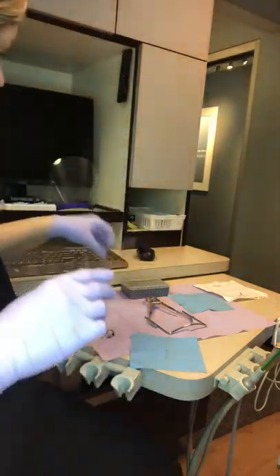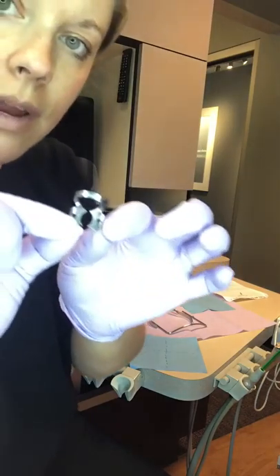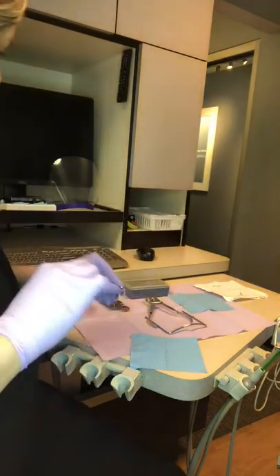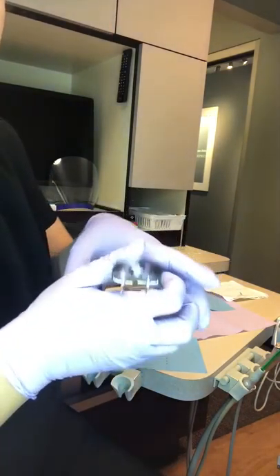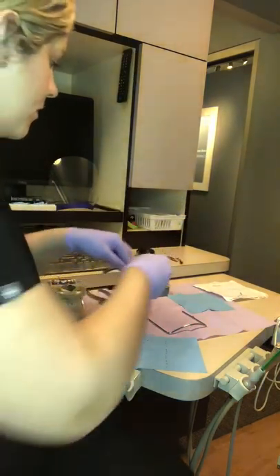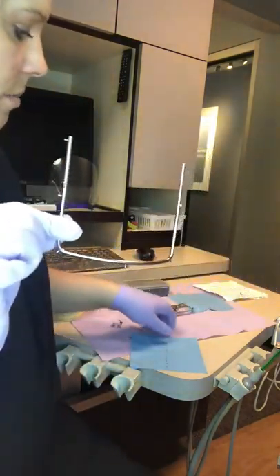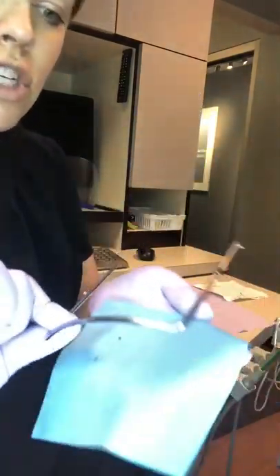For our clamp, we have the actual clamp here — this is what goes around the tooth and hugs the tooth. We have our forceps, which are used to go on the clamp to place it in the mouth on the tooth. We have our frame, which holds the rubber dam and gives it structure so it's not flopping around outside the patient's mouth.